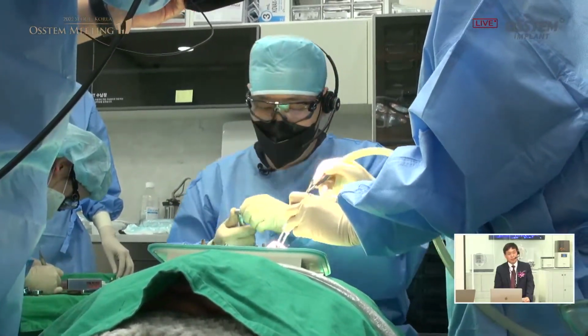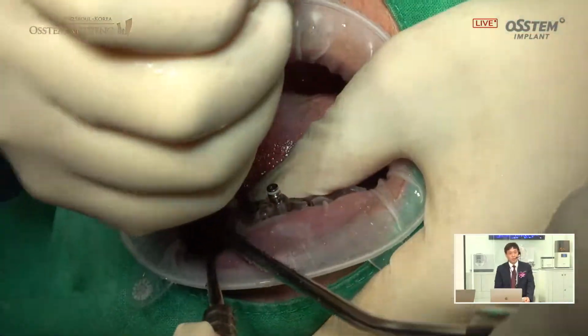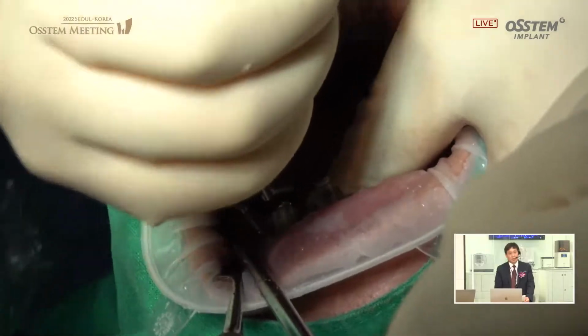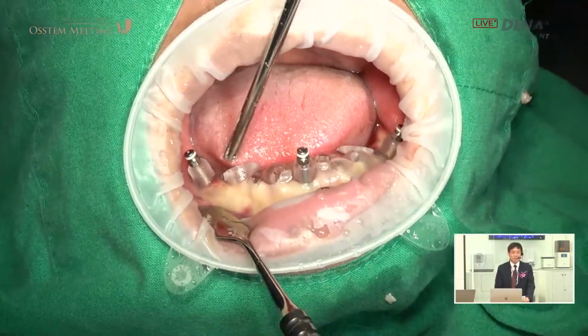For accurate placement, the flattening drill is used to remove the lumps and to prevent slipping.